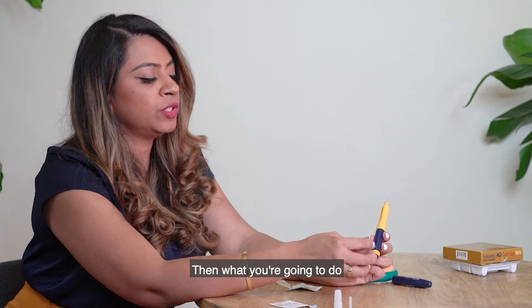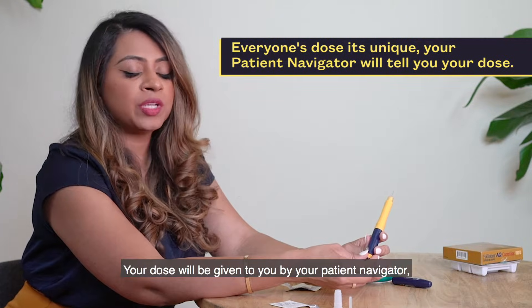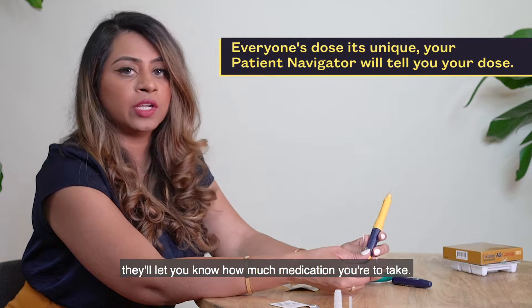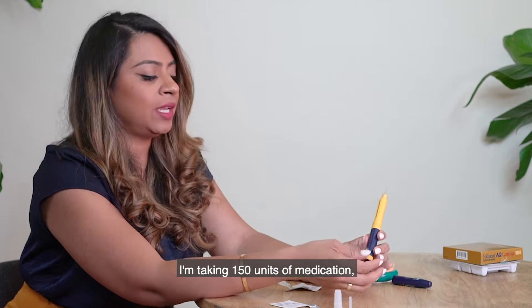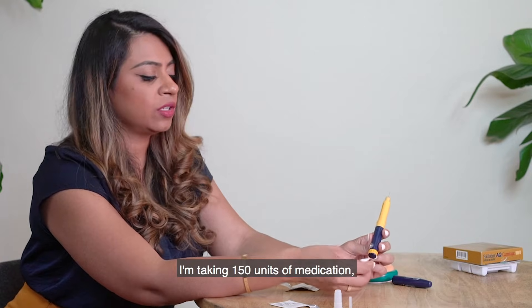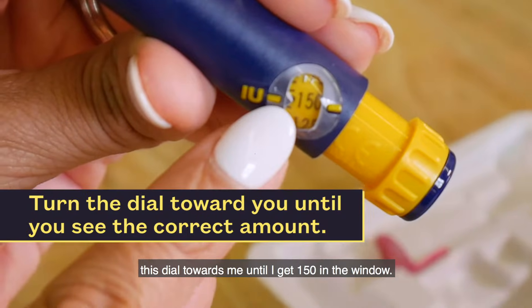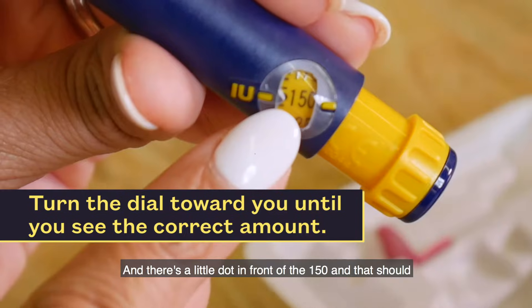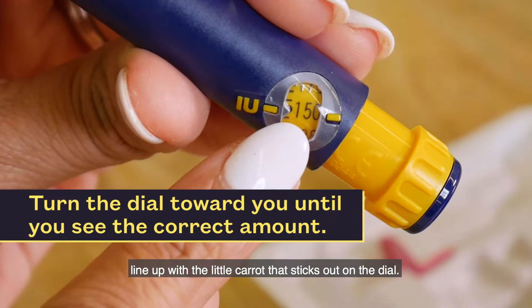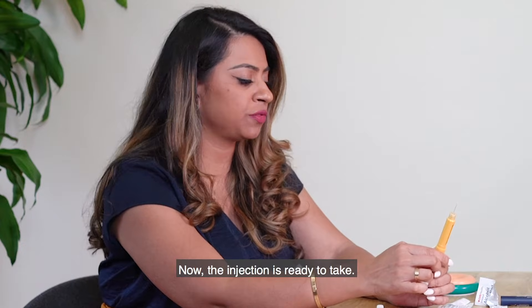Then dial your dose — every dose is different for every patient. Your dose will be given to you by your patient navigator. For example, if I'm taking 150 units, I'm going to turn this dial towards me until I get 150 in the window. There's a little dot in front of the 150 and that should line up with the little carrot that sticks out on the dial. Now the injection is ready to take.